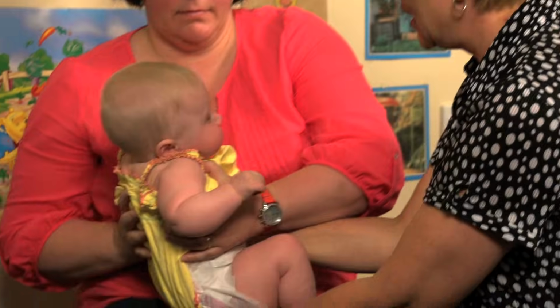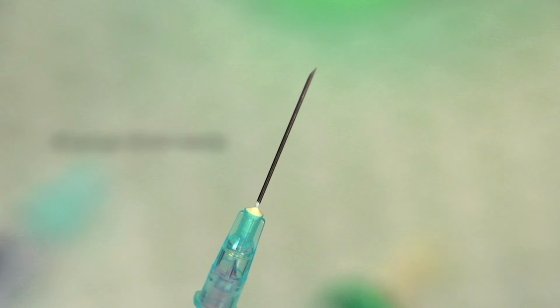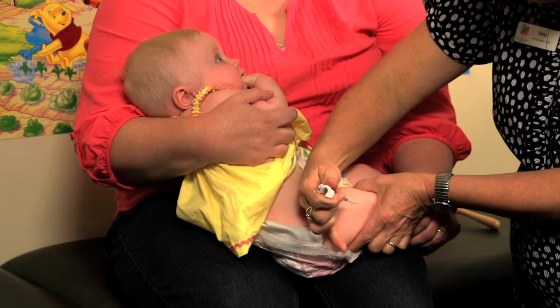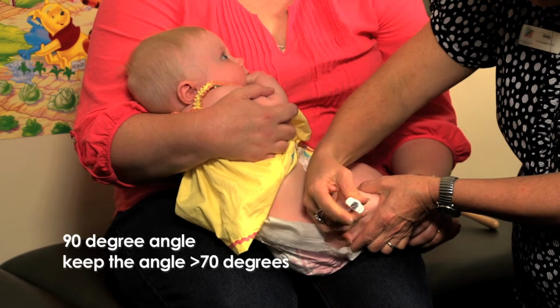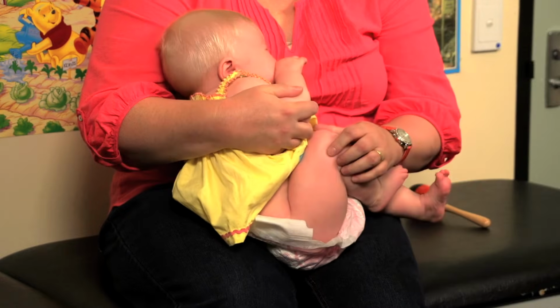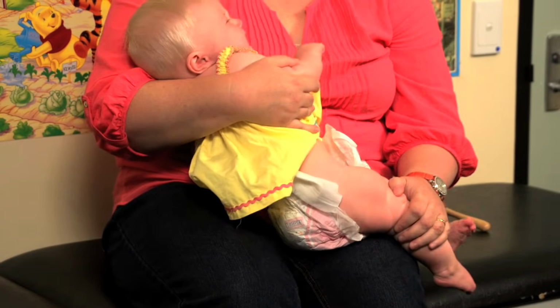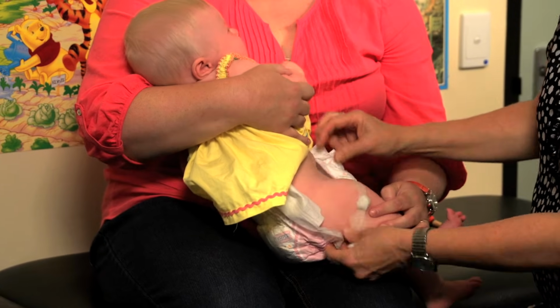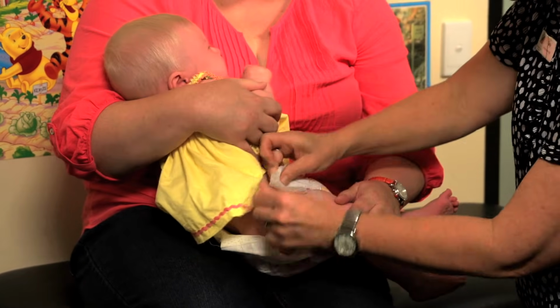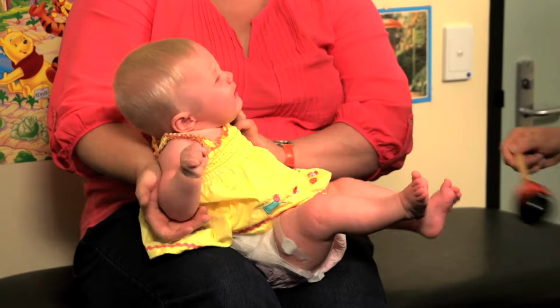Tell the parent to hold the infant firmly to reduce the risk of a needle injury to the infant, parent or nurse. Using a 23 gauge, 25mm needle, pierce the skin at an angle of 90 degrees. It is safe to insert the needle to the hub. Following the injection, cover the site quickly with a dry cotton wool ball, using tape only if required. In this case, tape is used to stop any blood spots going on mum while the second injection is given.